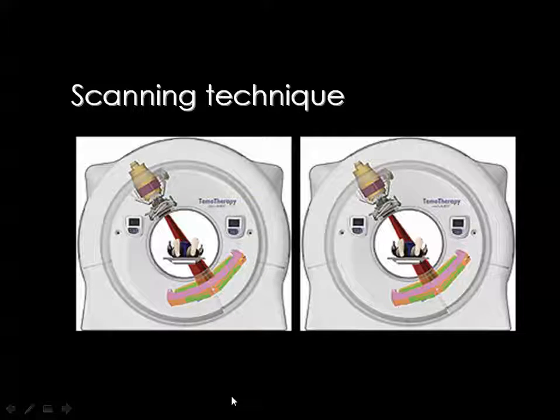In order to have a section in the human body, the X-ray tube should rotate around the human body in a full circle. And this was not feasible in the old machines because the X-ray tube is usually connected to the wall or to the ground by electricity cables.